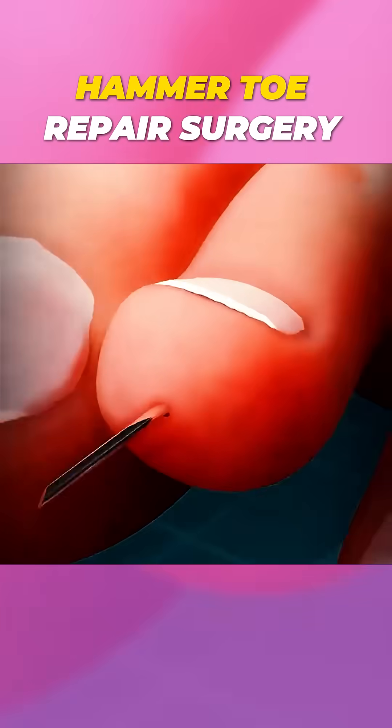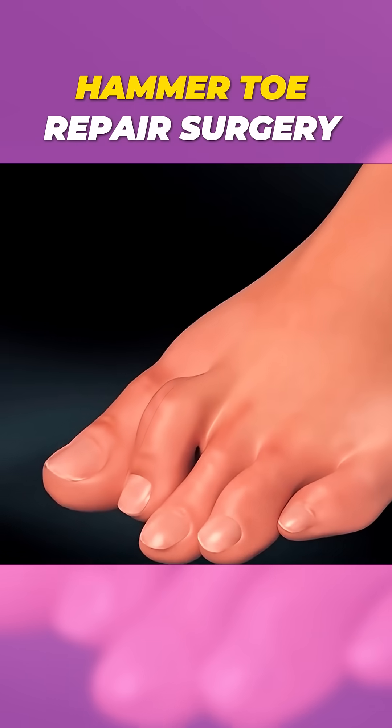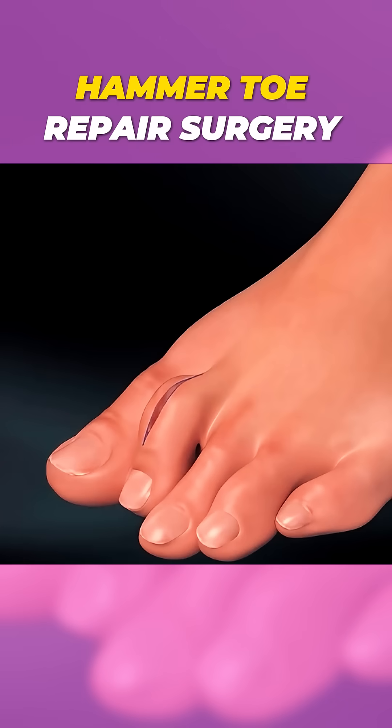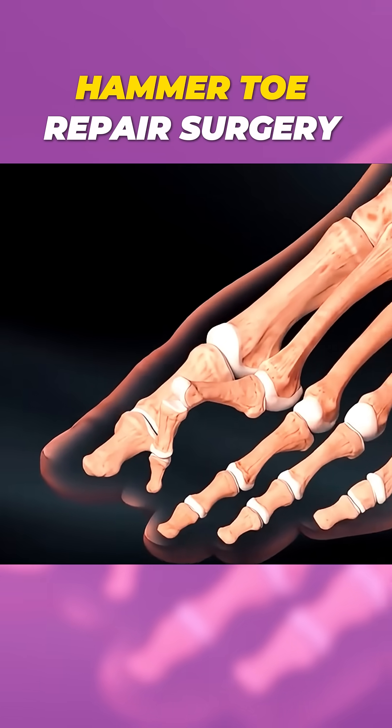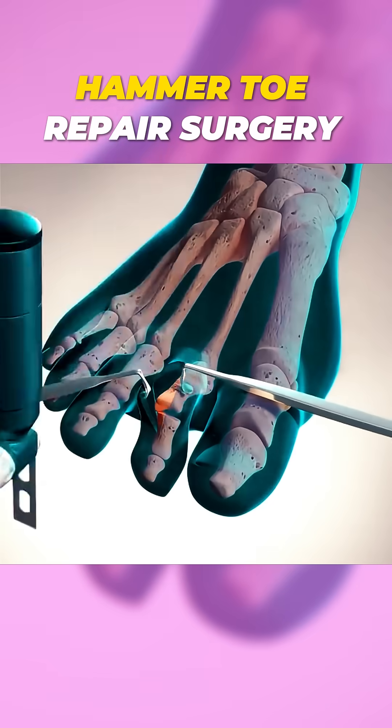Ever wondered how hammer toe repair surgery is performed? First, the patient is given anesthesia to numb the area or put them to sleep, depending on the procedure. Once the toe is numb, the surgeon makes a small incision over the affected toe. Through this cut, they access the bones and tendons causing the deformity.